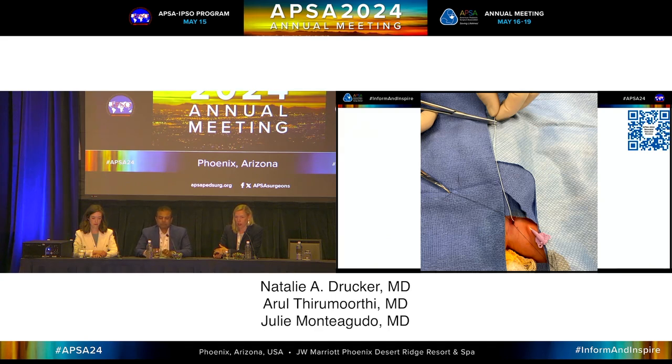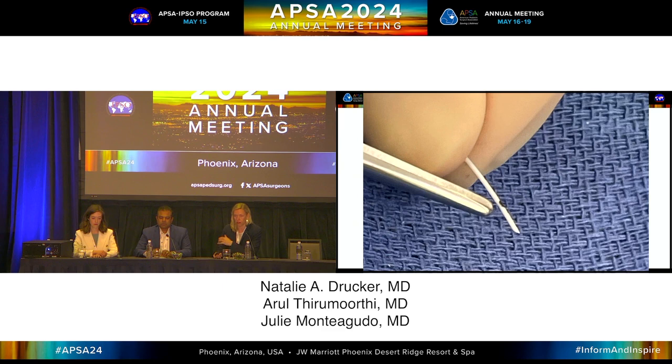And then cut it on a sharp bevel. Here's the picture, around the level of the xiphoid. So you can use fluoro if you have it. If not, just guess the level of the xiphoid and the path that it would take to get there.